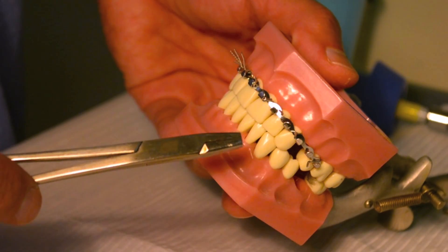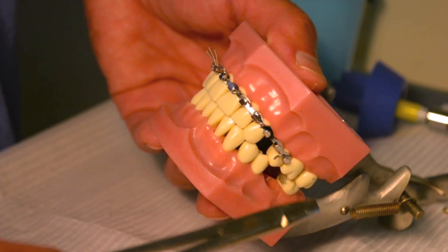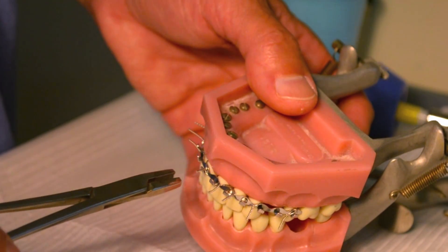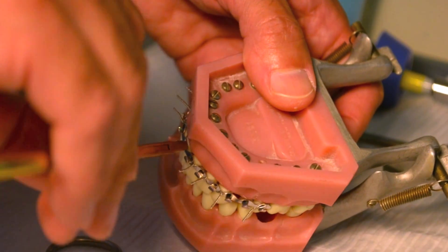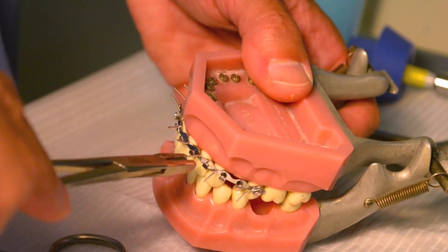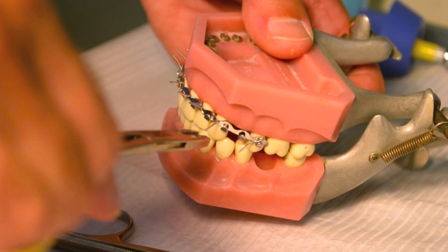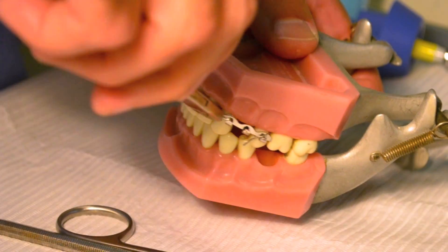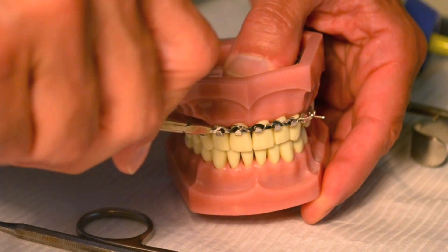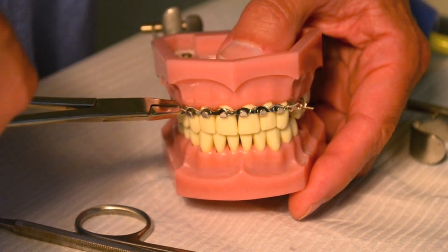Because the wires are made out of stainless steel, they have a tendency to stretch. Even between the initial placement and the time you reach the point of cutting the wires short, they will have already stretched somewhat. So it's always a good idea to go back and give your wires an additional turn or two to make sure you have them down to their full tightness. Remember: always tighten in a clockwise direction, and loosen in a counter-clockwise direction. Always pull on the wires as you tighten to apply traction so that the wires do not curl up on themselves.